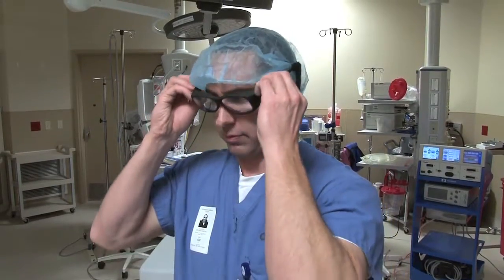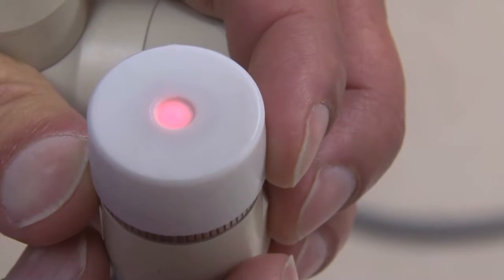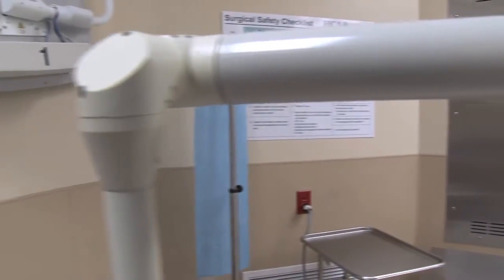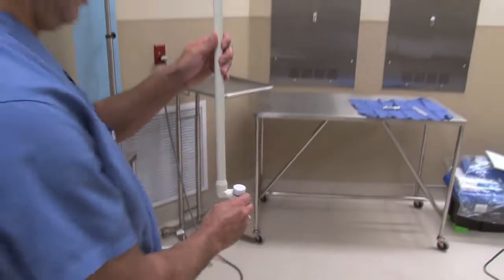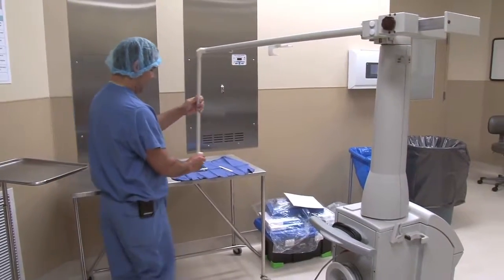Wearing the appropriate laser safety eyewear, observe the alignment of the aiming beam as it exits the arm. If the beam is not centered in the arm, first make sure the arm is deployed properly. Then walk the arm around the laser and rotate the knuckles of the arm to see if that corrects the beam's alignment.